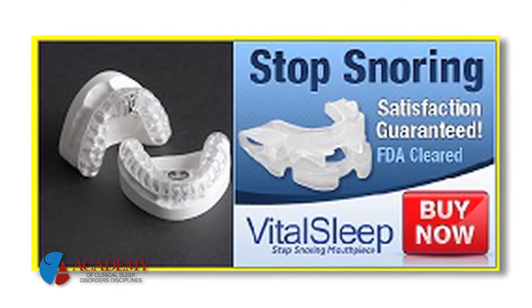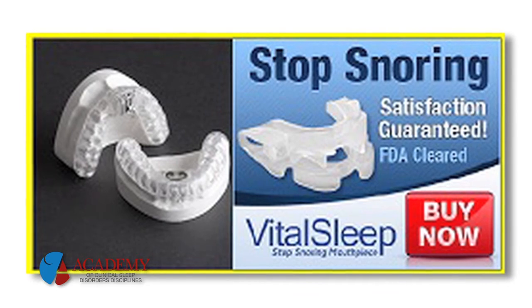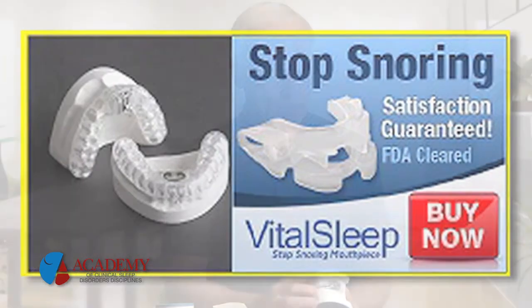They're all adjustable. You'll see the over-the-counter ones advertised on television, though, where you can boil it and bite into it and you get one position. Those tend to be very bulky and not very durable. They actually do work in some cases, but not near as effective as the custom appliances like the SomnoMed.